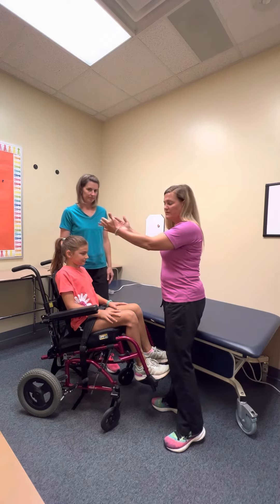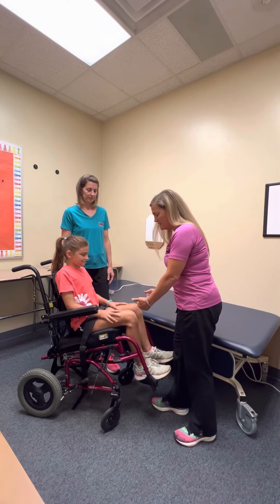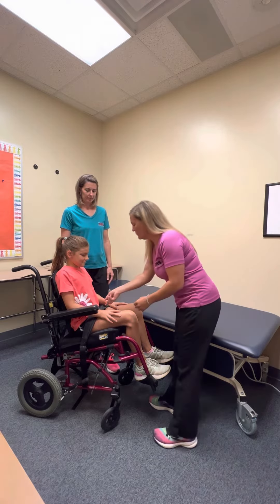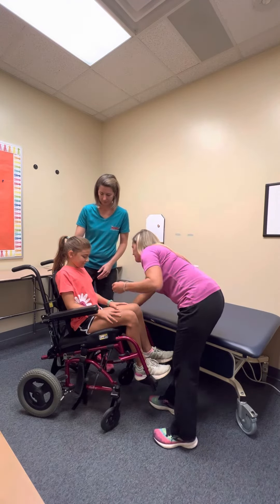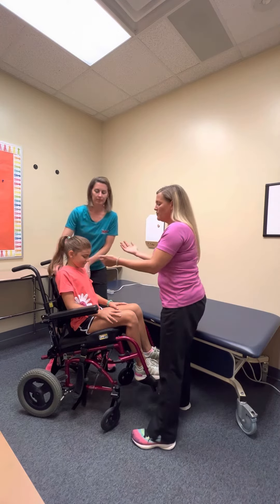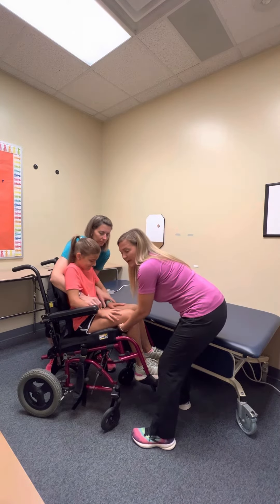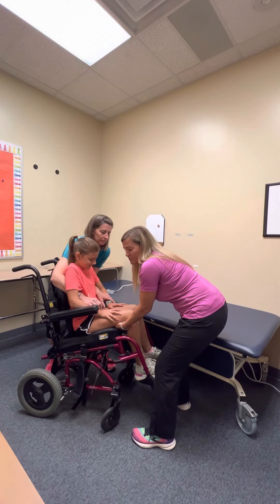One person is going to be up top and the second person is going to be supporting the legs. We can remove the seat belt, the top person will reach under the trunk and the other person will reach under the legs. You want to work together so it's a smooth motion.